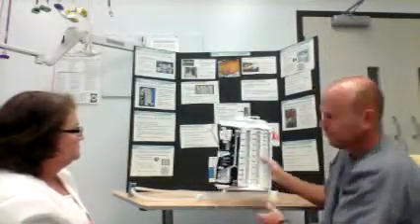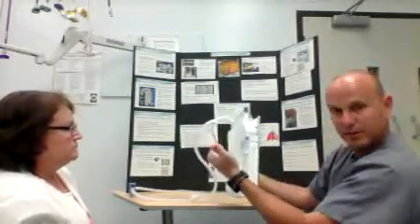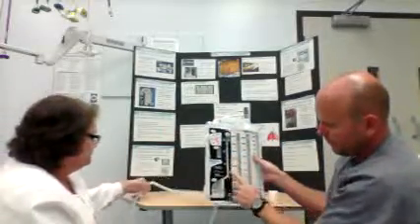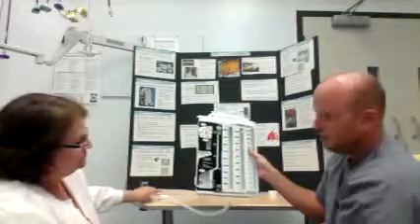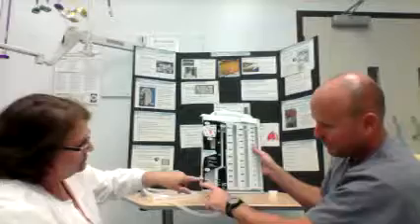So in this particular model, when you get it out of the pack, on the back side, now this one's been removed, but right here is a syringe, and it's got the predetermined amount of water in it that is required for your water seal. You take the pre-filled syringe, right here on the blue suction port, put your syringe on, and you fill. Now this water will go down here into the water, 2 centimeters into the water seal chamber. Okay? And it'll turn blue, and it'll be up to the 2 centimeters. So that's the first thing you have to do.